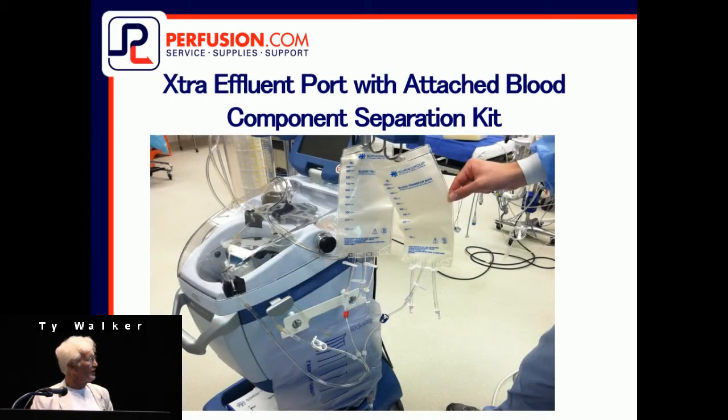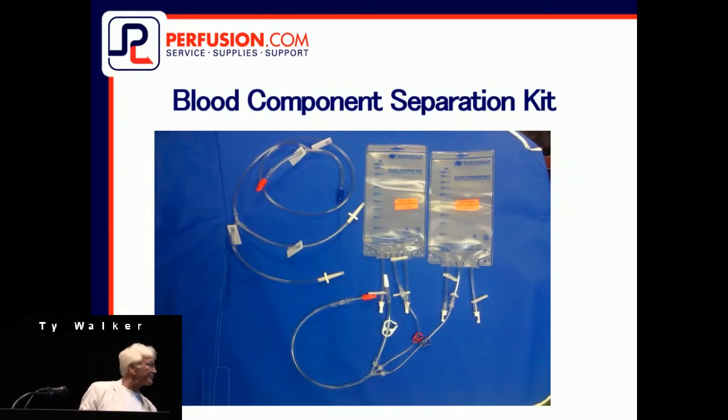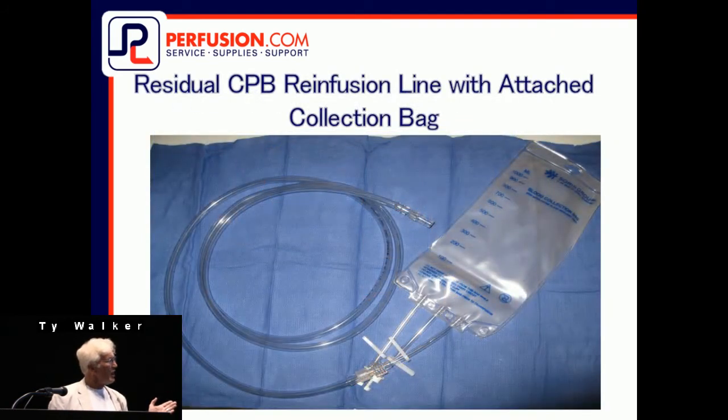And what we did is we looked at the effluent volume port. We clamp off our waste bag. They do a bag of ANH. And again, here are the separation bags. Another technique is when they hand off the autotransfusion line, they also hand off a bag that has a 3/8 inch connector that they tuck into the drapes. So at the very beginning of the case, when they hand off the line, they hand off this other line, we hang that bag on the pole, and we hook it up to our ancillary spike, which you'll see in the back room.